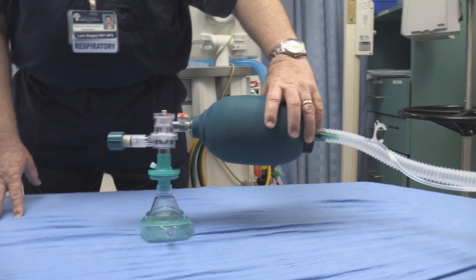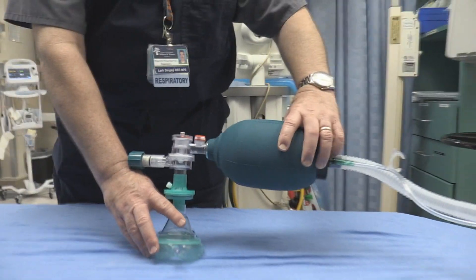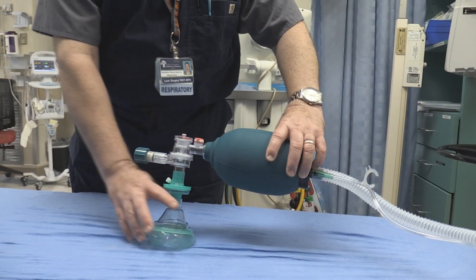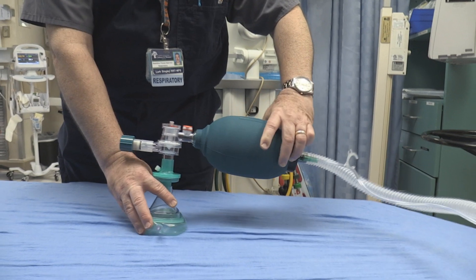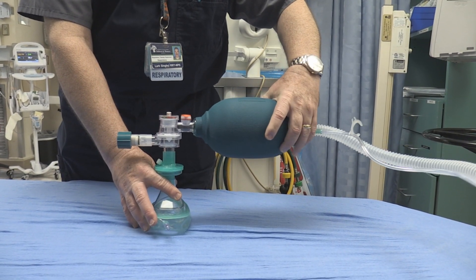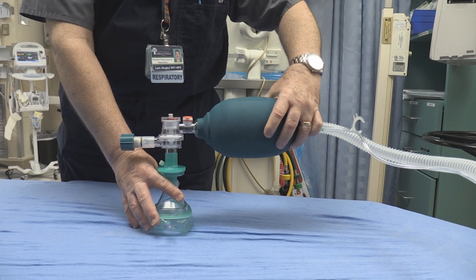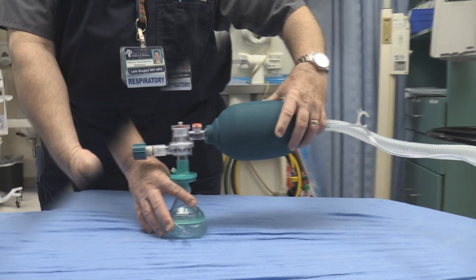Basically what you have to do is bag a little bit — gently bag. We have to create some type of flow to the patient. So usually we will just gently squeeze, keeping a light seal over the patient, and that creates the flow for the patient to hyper-oxygenate.